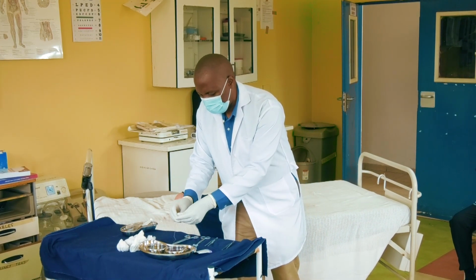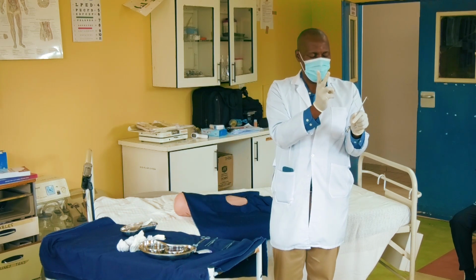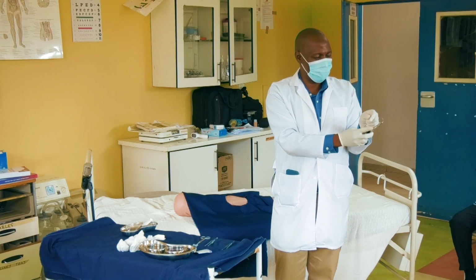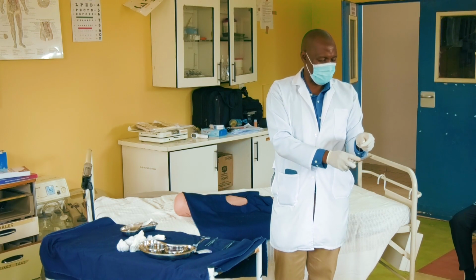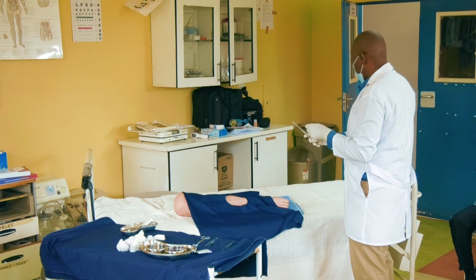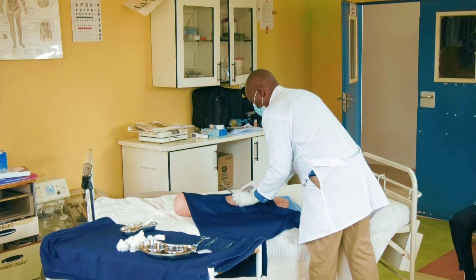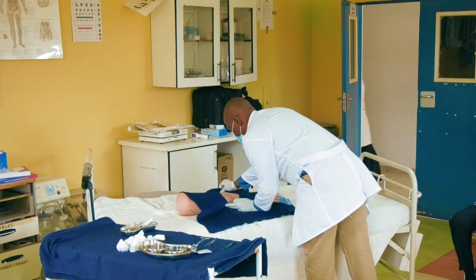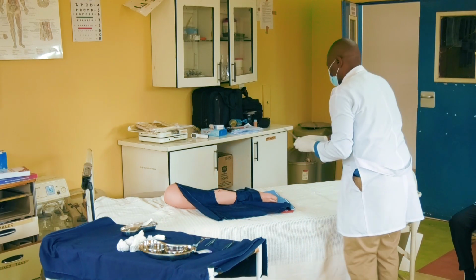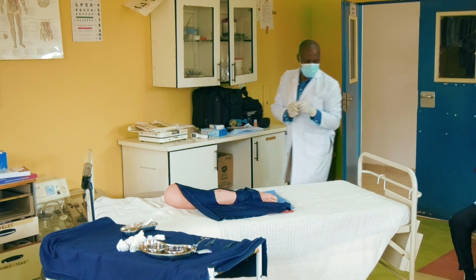Okay, so you get your, remember, ring finger, and because these two, they will be helping you, you will stabilize very well as you are working. Right? Now, I hope people will be seeing, or where should I stand so that people can see the other side. Now it's going to be a bit difficult. Okay. Let me just stand the other side, but I'm supposed to be this side. Forgotten one thing.